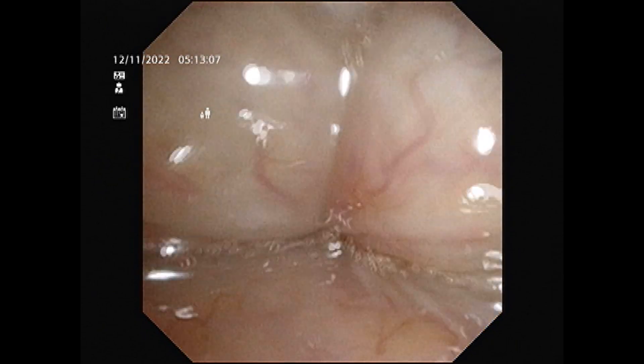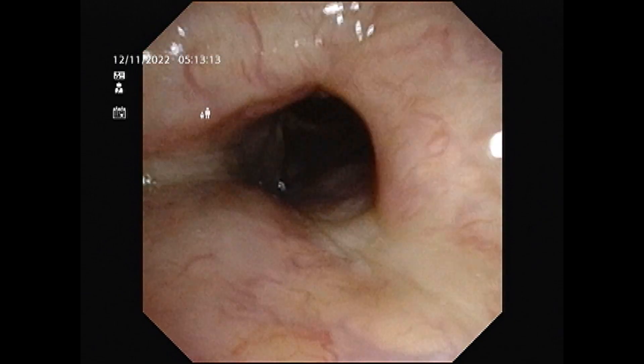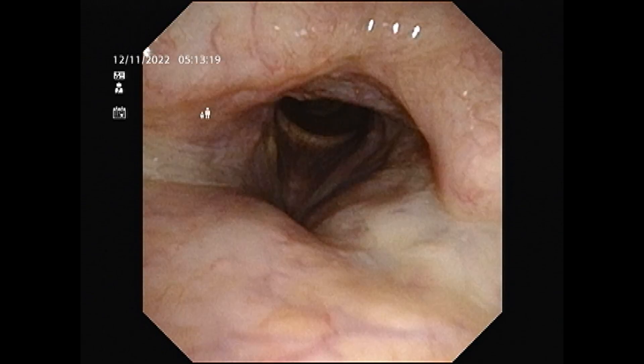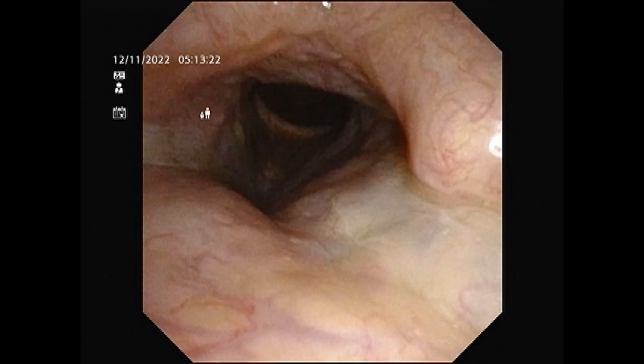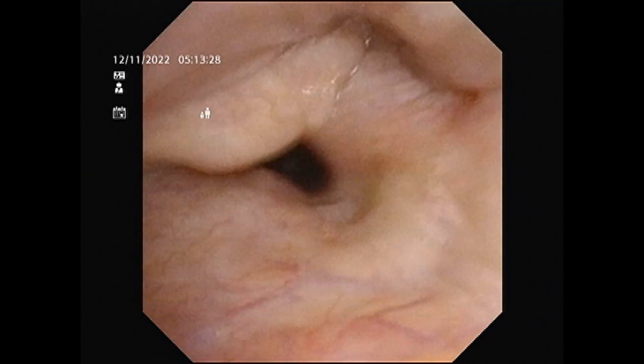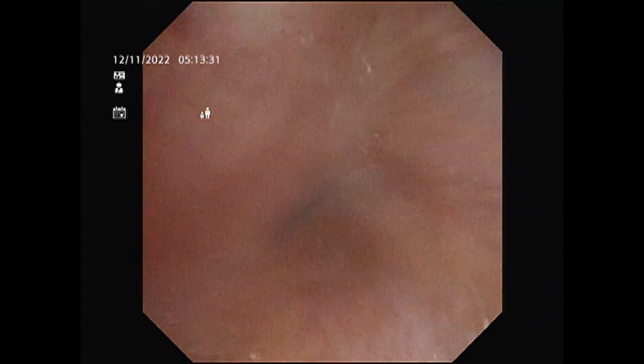The patient cannot sleep properly without a CPAP machine and has been on CPAP for about two and a half years. But it is becoming more and more of an issue — even with CPAP the patient is not getting sound sleep. As you can see, there is complete obstruction at the level of the soft palate, and I am finding it hard to control my endoscope because of severe muscular activity. You can see severe vibrations at the AE fold level and severe closure of the airway as the patient tries to breathe — this movement is why the patient snores so loudly.